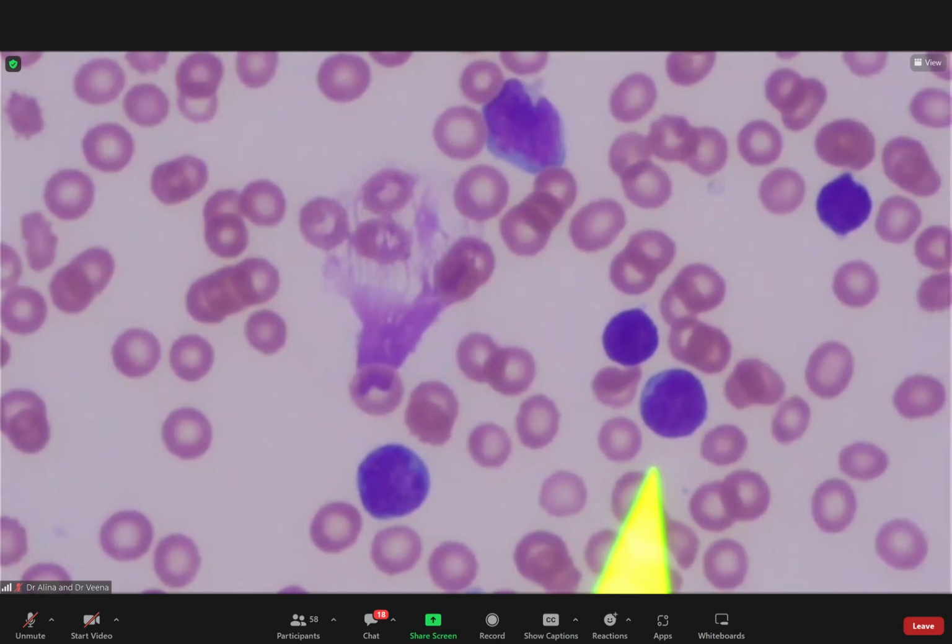Okay, sometimes you can have a high white cell count, a lymphocytosis, in infections. You can, okay, but clearly the morphology will be different. So in a reactive lymphocytosis in a child, you would have very large lymphocytes with reactive morphology. So scalloping cytoplasm, right? Abundant cytoplasm. They wouldn't be like this. Granulation. Okay, sometimes they'll have toxic changes, sometimes they'll have LGLs. Okay, so we want you to be able to identify that these are blasts, right?